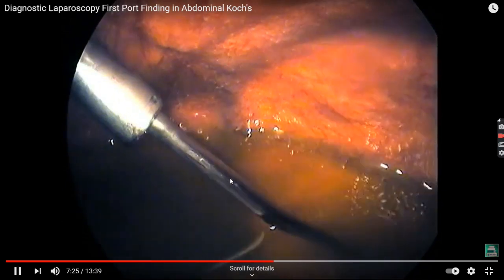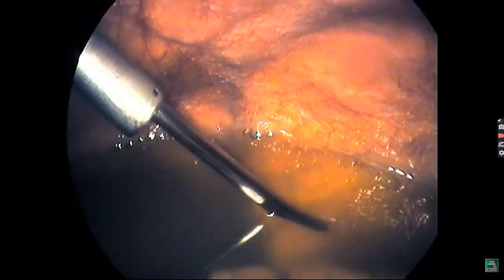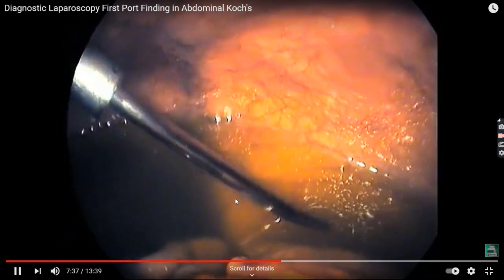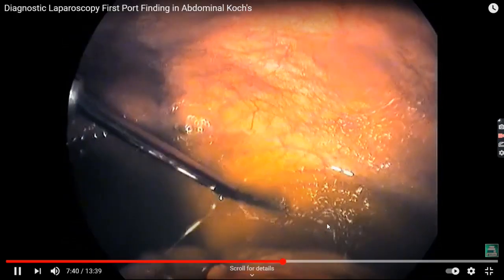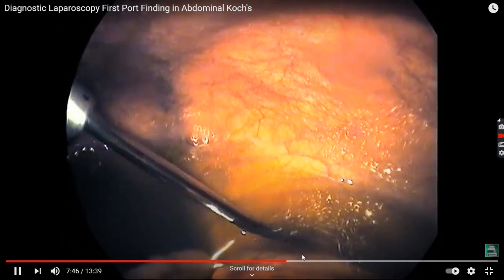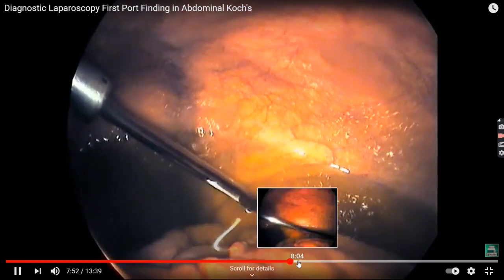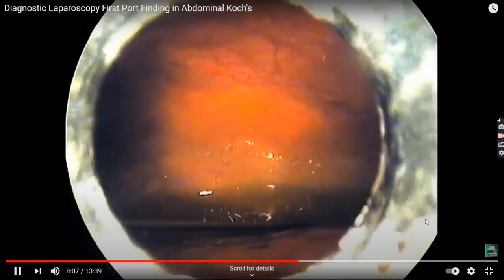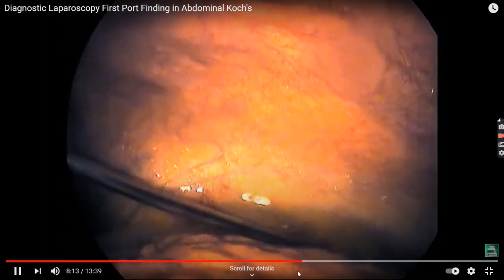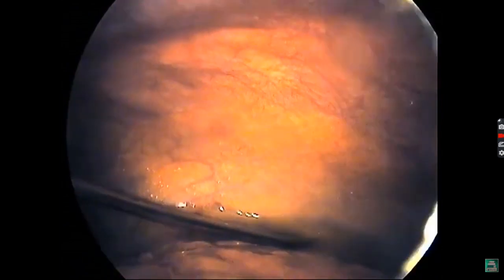The idea is to slowly decompress the abdomen of this patient. So we took our time, proper time, to just take out the ascitic fluid almost completely, and like this you can see sucking it out, and as we are taking out this ascitic fluid, everything, the other structures are clearly visible now.